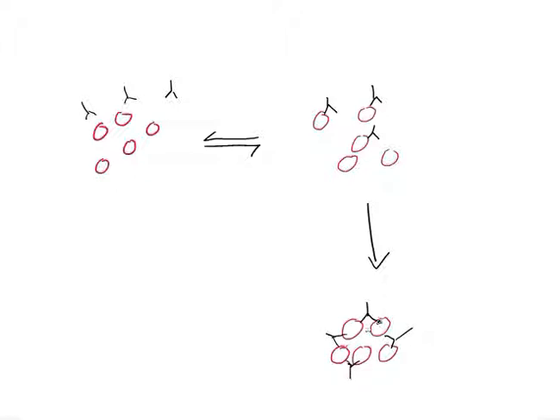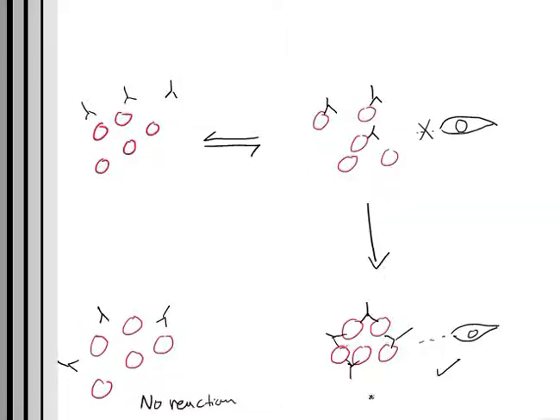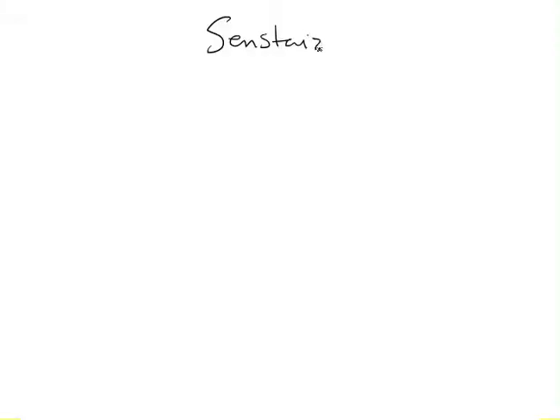So we cannot see the sensitization step by our eyes. However, we can see the agglutination step. So this is the end stage of tests. So if there are no RBC antibodies in the serum, or if there is no corresponding antigen to the existing antibody, no agglutination will happen. So in sensitization step, the antibody will bind to the corresponding antigen on the red blood cell surface.